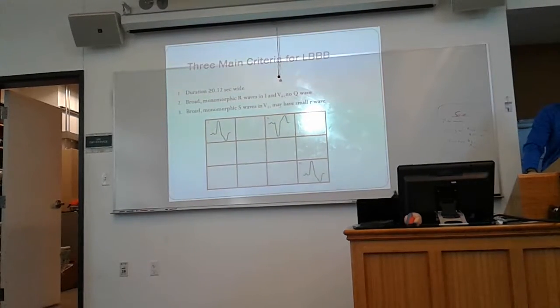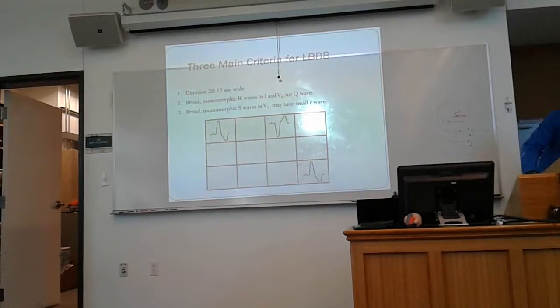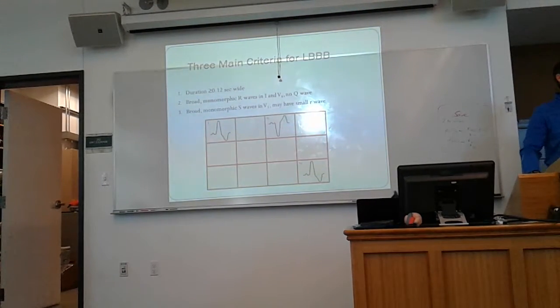What lead helps you to know that it's supraventricular? Lead 2. Okay, lead 2 does. What other lead might show it? AVL, a little bit, a tiny bit. Yeah, the very lead that we just, in the last one, looked at to say, this is ridiculous, is the very lead that we would want to look in here, right?